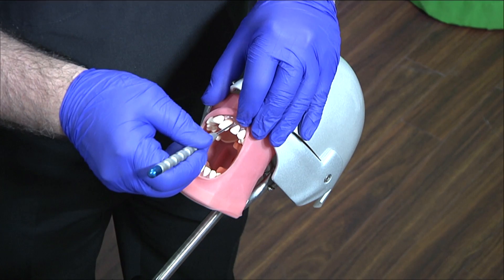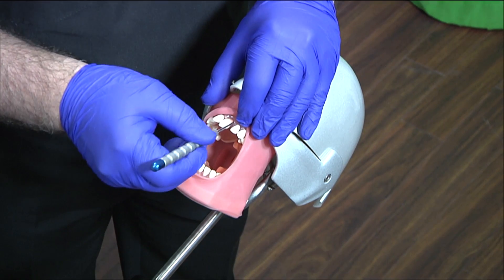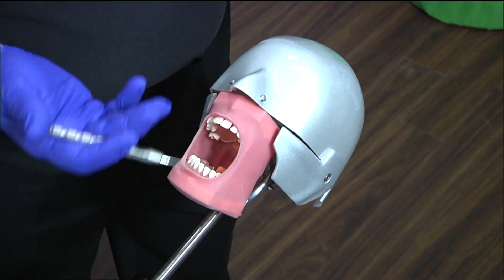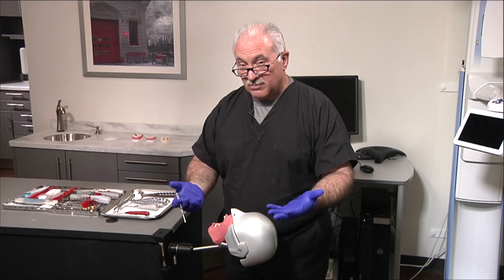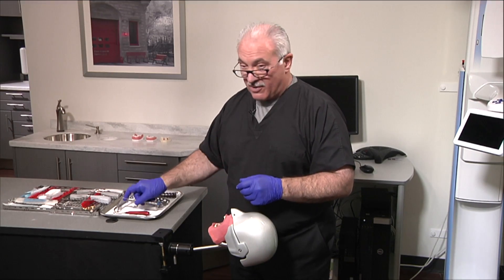I'm not gripping it, I'm not ripping it — it's finesse, not force. You can loosen it up. Your alternative would be to reflect the flap, remove buccal bone, replace the flap, suture it, and then you have an alveolar defect.